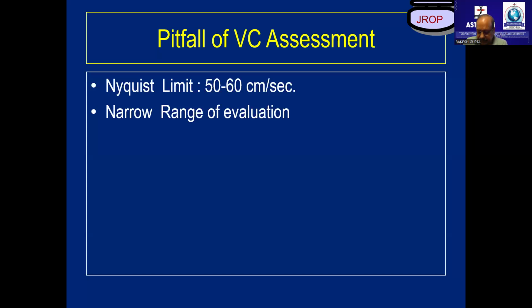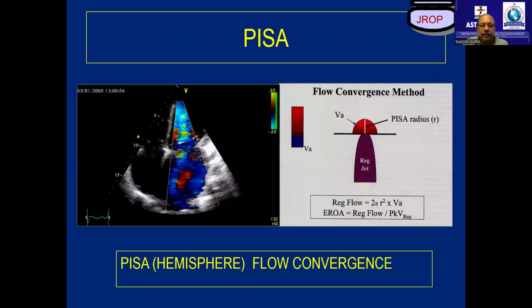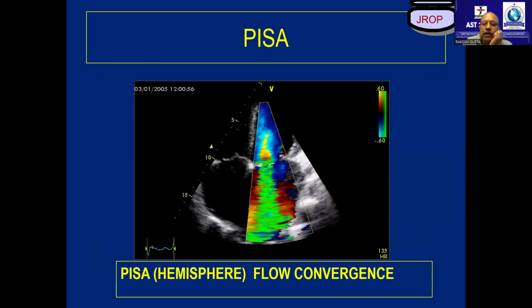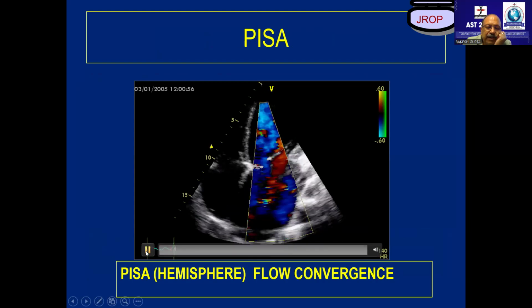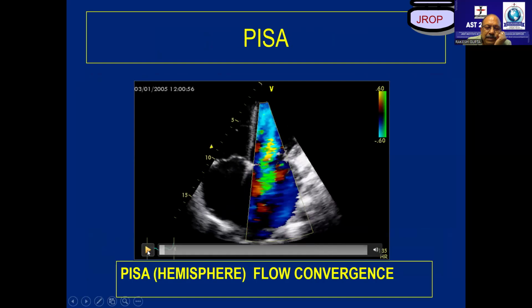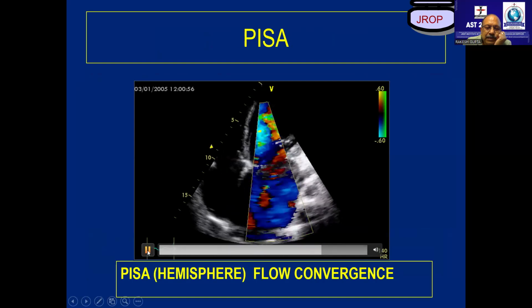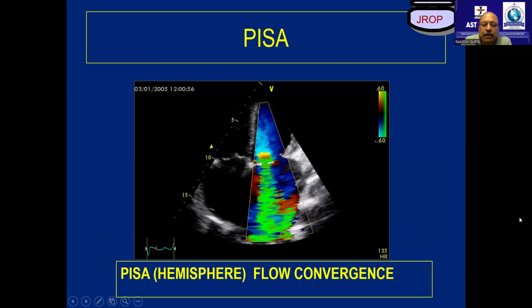Can you see the slides? Yes, sir. Okay. Now look at this severe mitral regurgitation. If I hold this slide, okay. Now this is a severe MR, right? What do you see over here? You see multiple hemispheres.